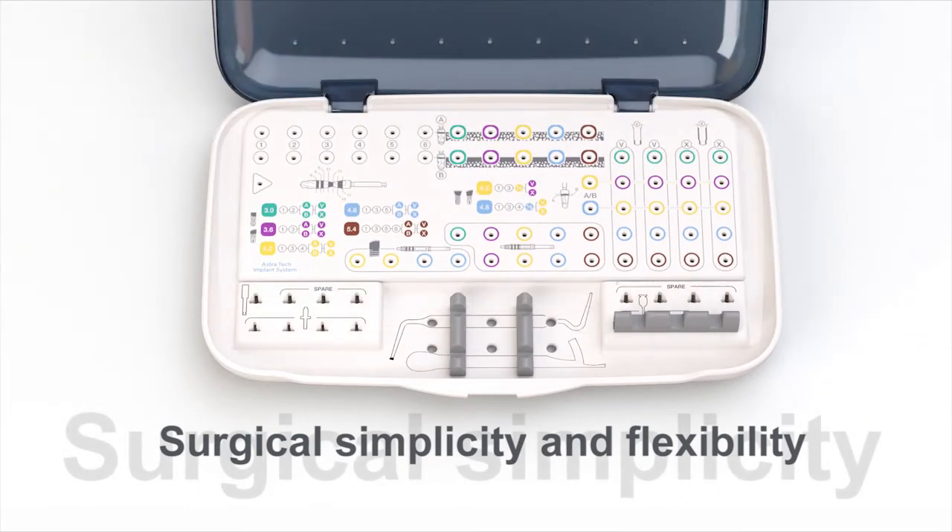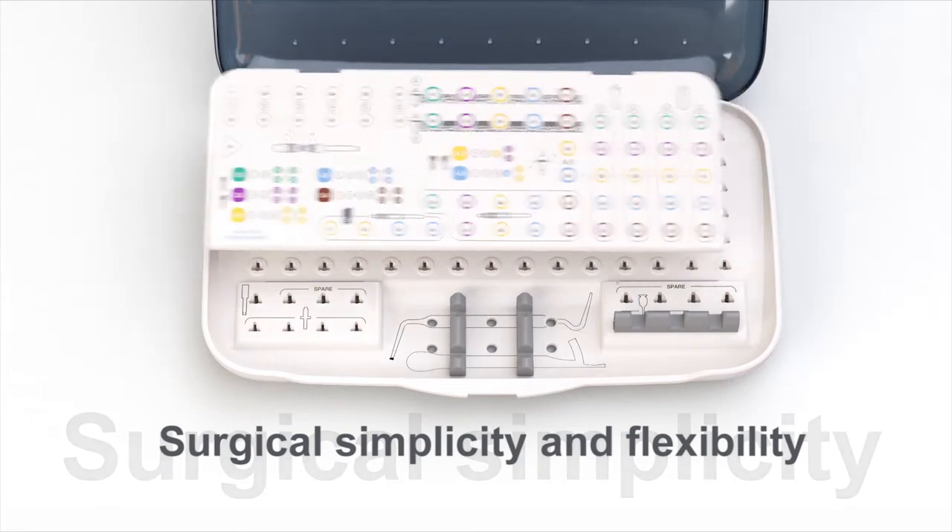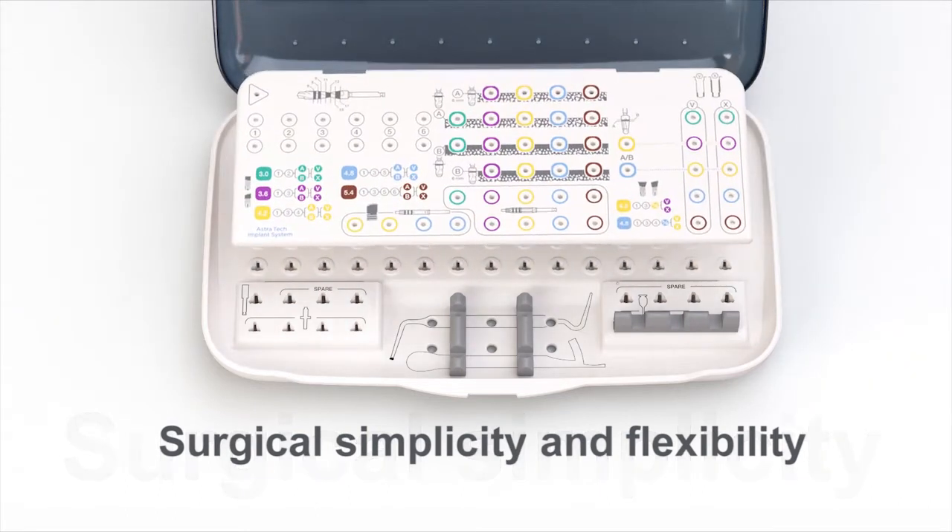Three interchangeable overlays allow for adaptation according to your clinical preferences. As a surgeon who places implants, I love the drilling and the drilling sequence. I love the drills — the quality of them, the way they cut, and also the fact that the surgical protocols have been made easier.